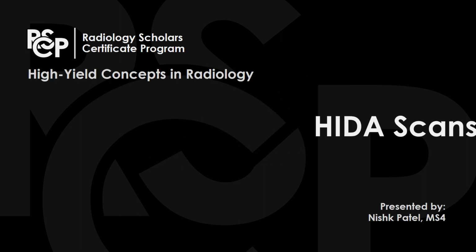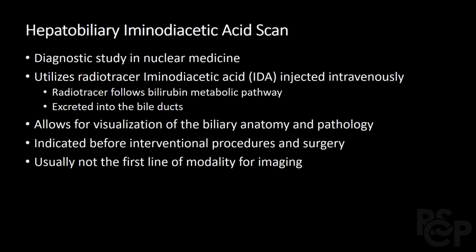Hello everyone, in this video we're going to be discussing HIDA scans. So HIDA stands for Hepatobiliary Iminodiacetic Acid scan. It's a diagnostic study utilized in nuclear medicine. It utilizes the radiotracer iminodiacetic acid, or IDA, which is where the name comes from.